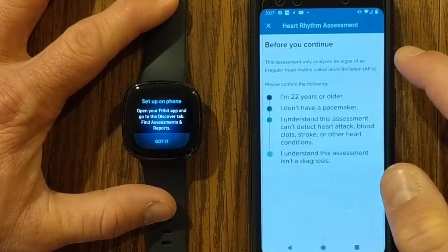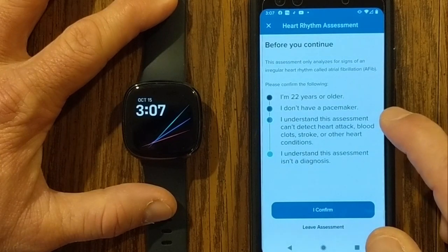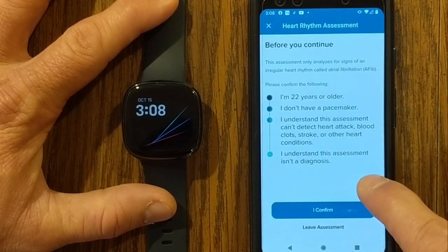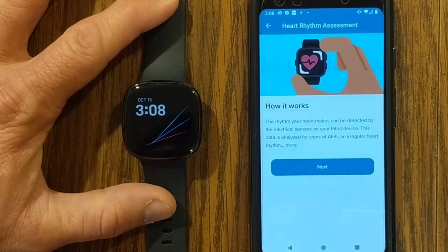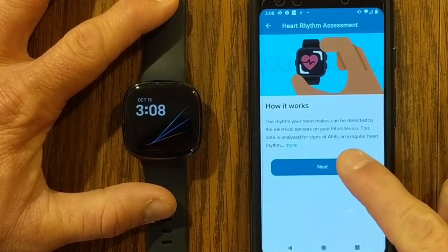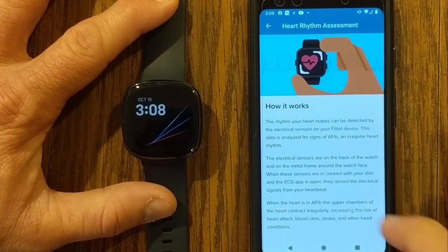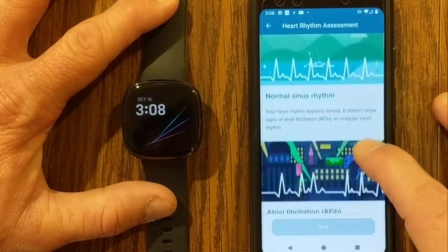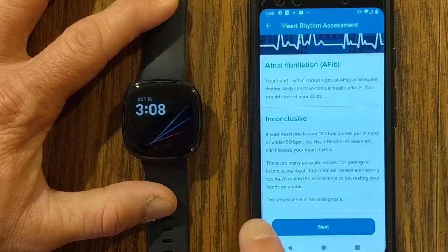Before you continue, this assessment only analyzes for signs of an irregular heart rhythm. Please confirm the following: I'm 22 years old, I don't have a pacemaker, I understand this assessment can't detect heart attack, blood clots, stroke, or other heart conditions, and I understand this assessment isn't a diagnosis. I'm going to confirm. It then goes through how it works — the rhythm of your heart can be detected by the electrical sensors on your Fitbit device, and this data is analyzed for signs of AFib. Next, it shows the results I might see: normal sinus rhythm, AFib, or inconclusive. Again, this assessment is not a diagnosis.